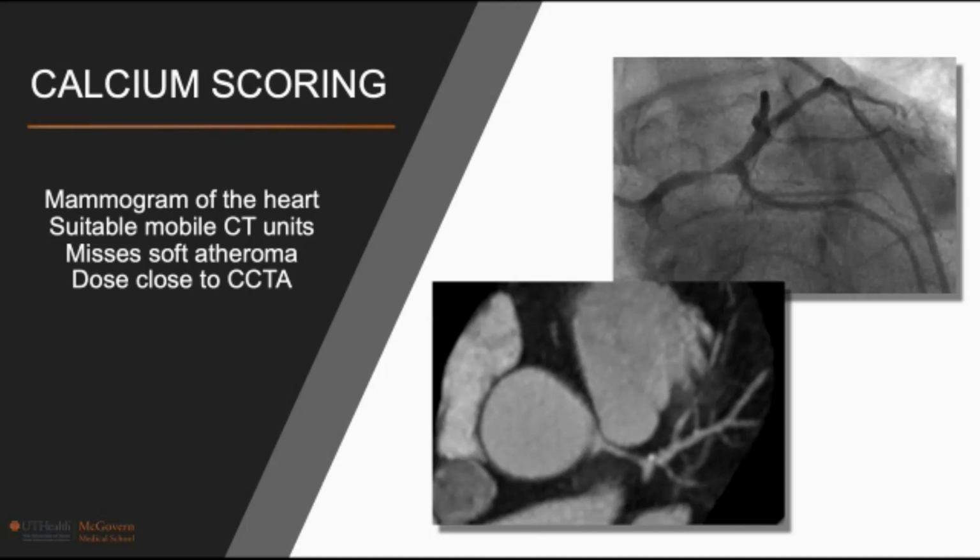Because of the simplicity of the study, and because of the ability to perform this with earlier generation scanners, I think this is perfectly suitable as a modality for mobile CT units, part of a larger screening program which hopefully will develop for early detection of coronary artery disease.